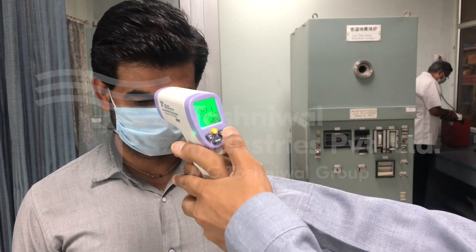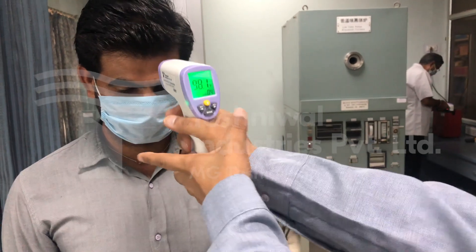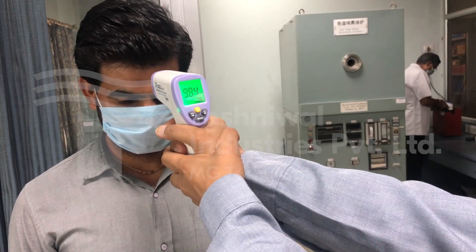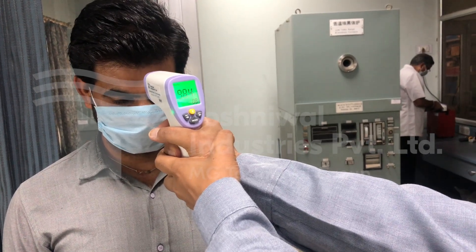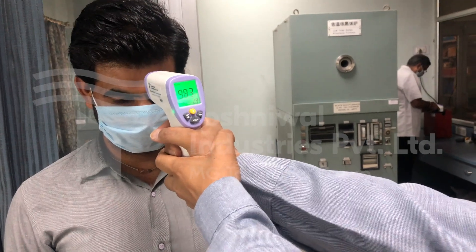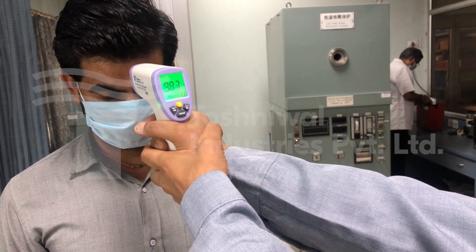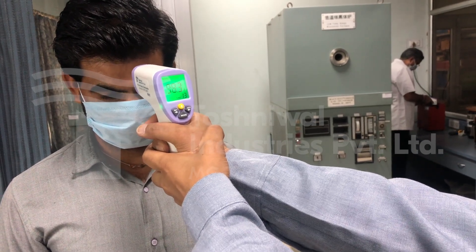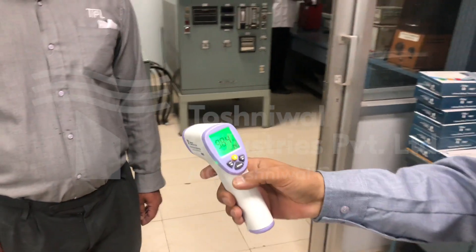Every time I move this, the log will increase by one. So now I'll take some measurements on the go: 98.4, 98.4, 98.4, 98.3. So we're taking multiple measurements, and within 0.1 degree we are able to measure.